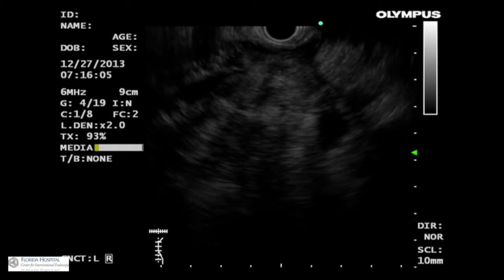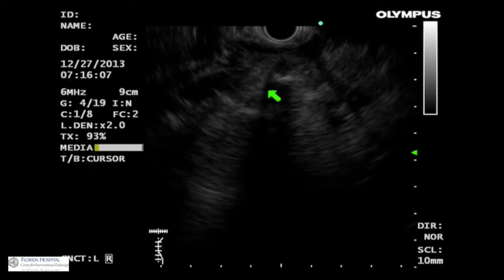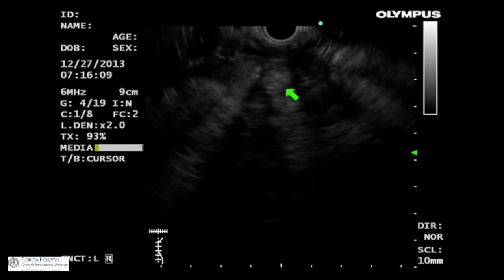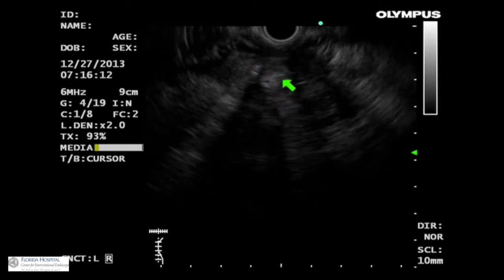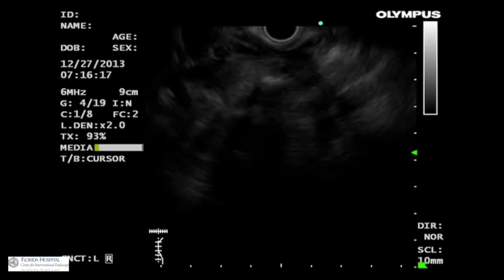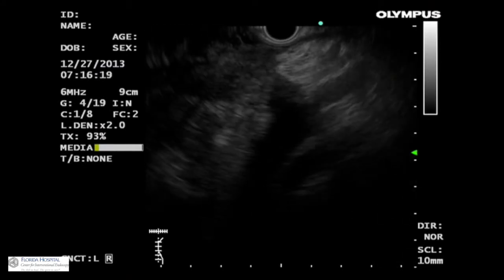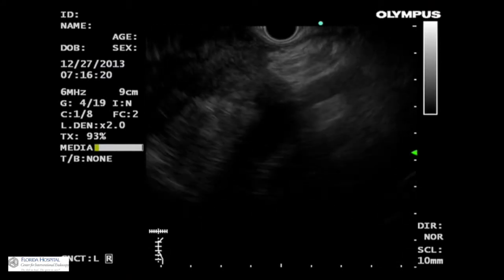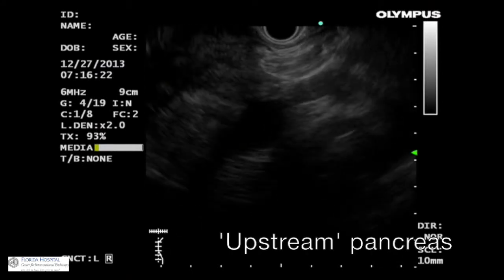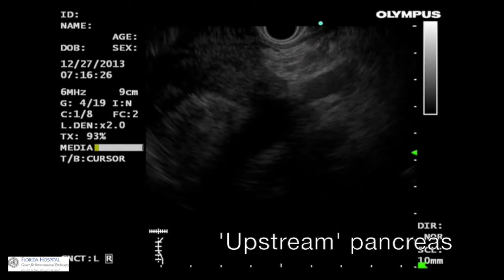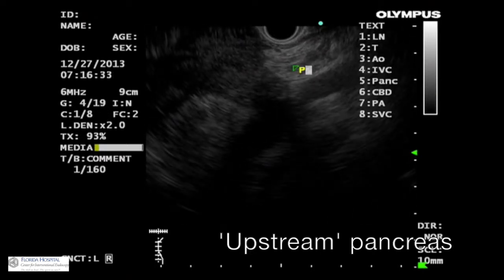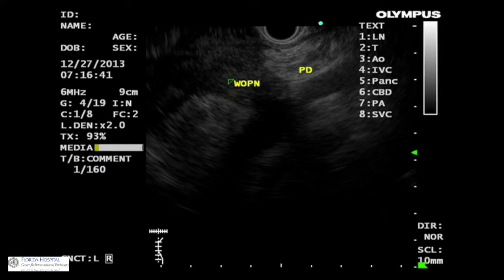On EUS, the stents could be seen within the hypoechoic resolving collection. To the right of the resolving collection was the upstream pancreas. The pancreas appeared hypoechoic and relatively preserved. The pancreas and small calibre pancreatic duct were completely disconnected from the collection.